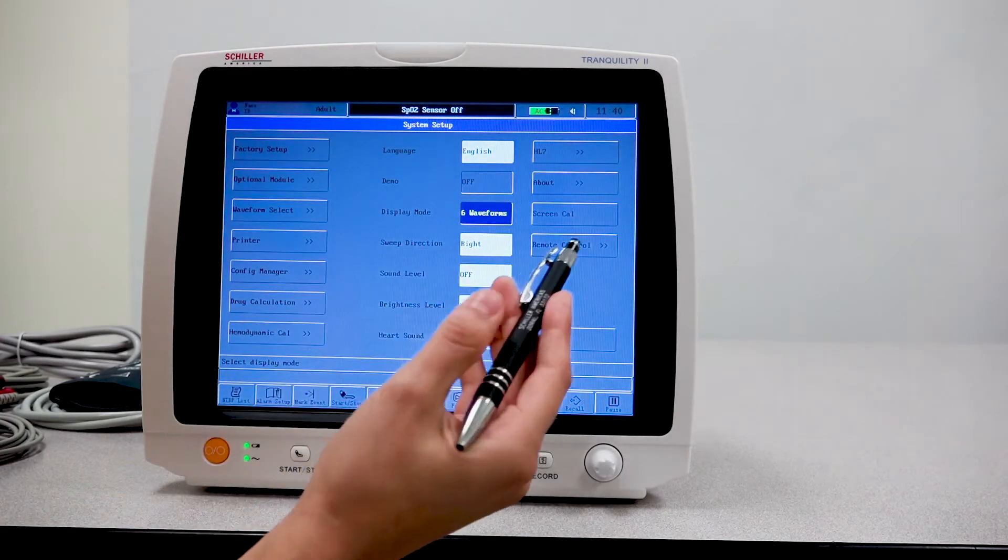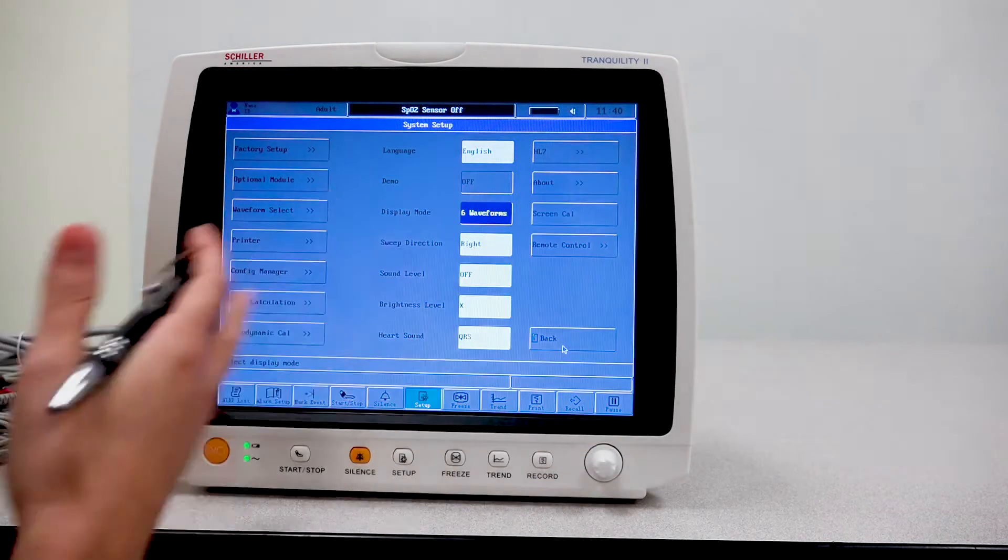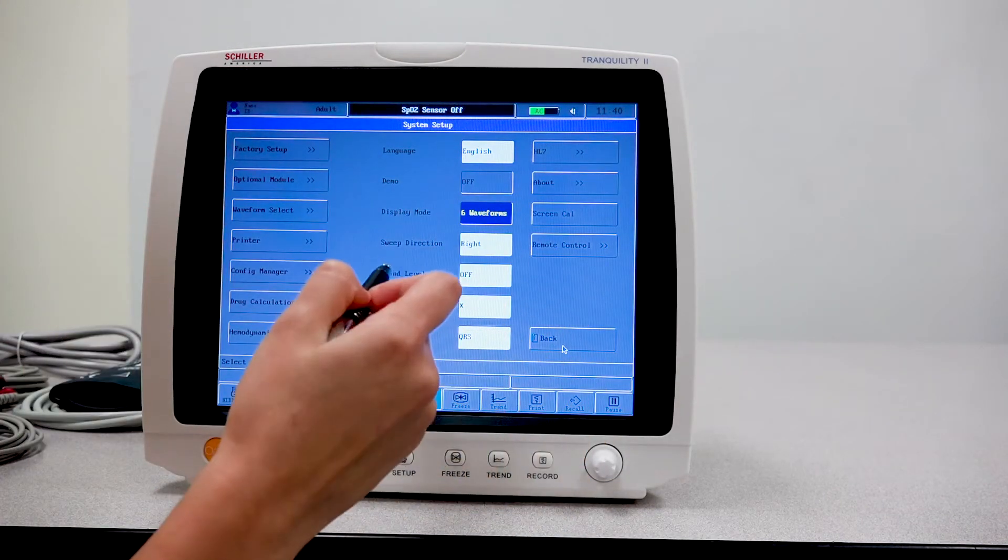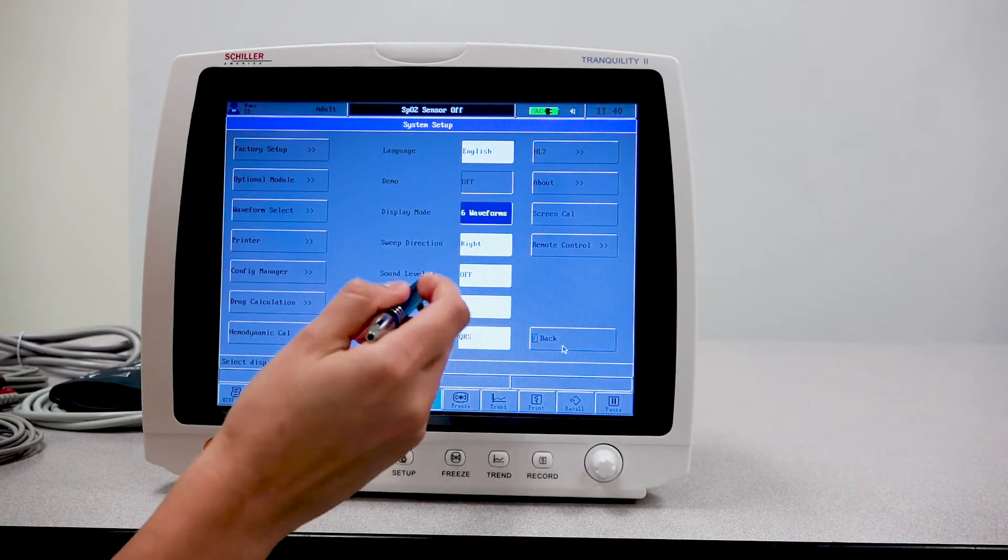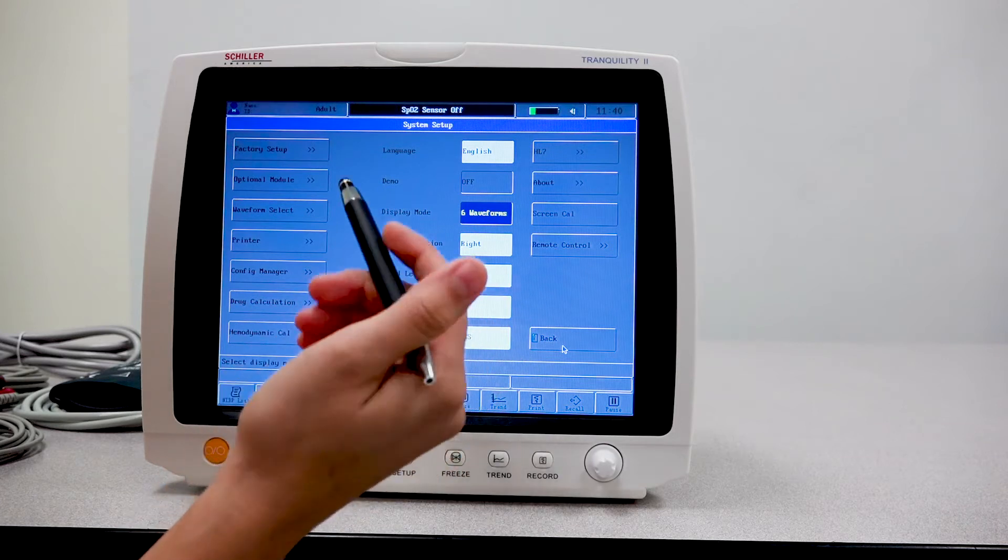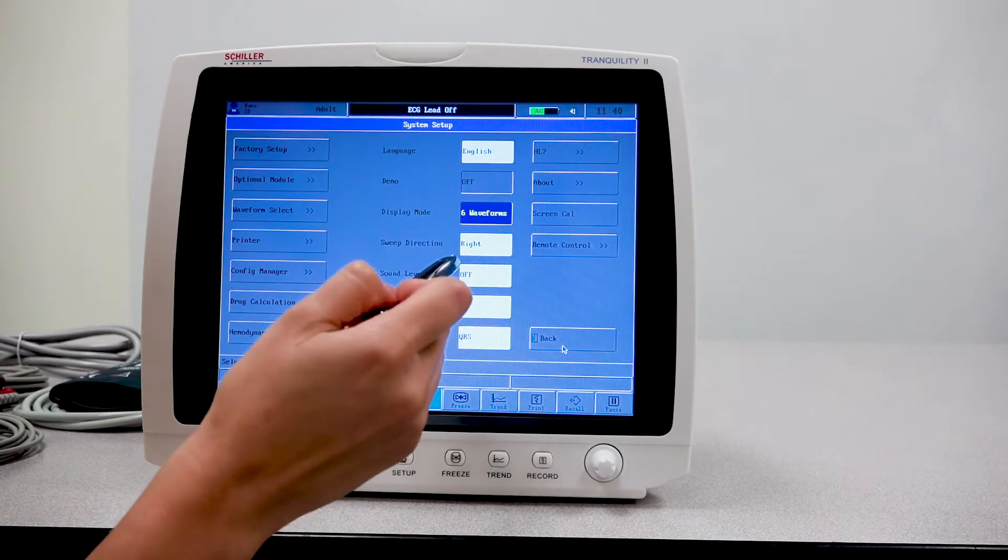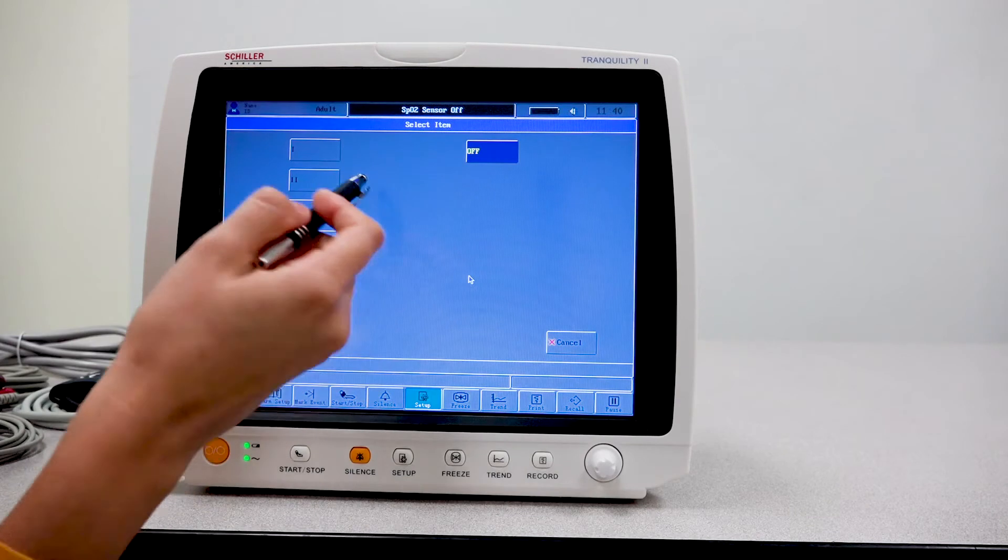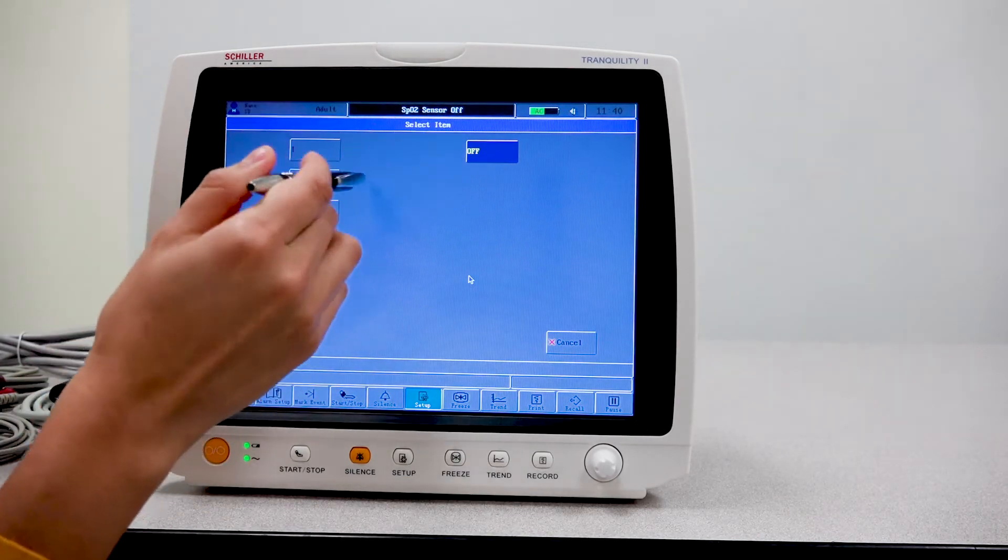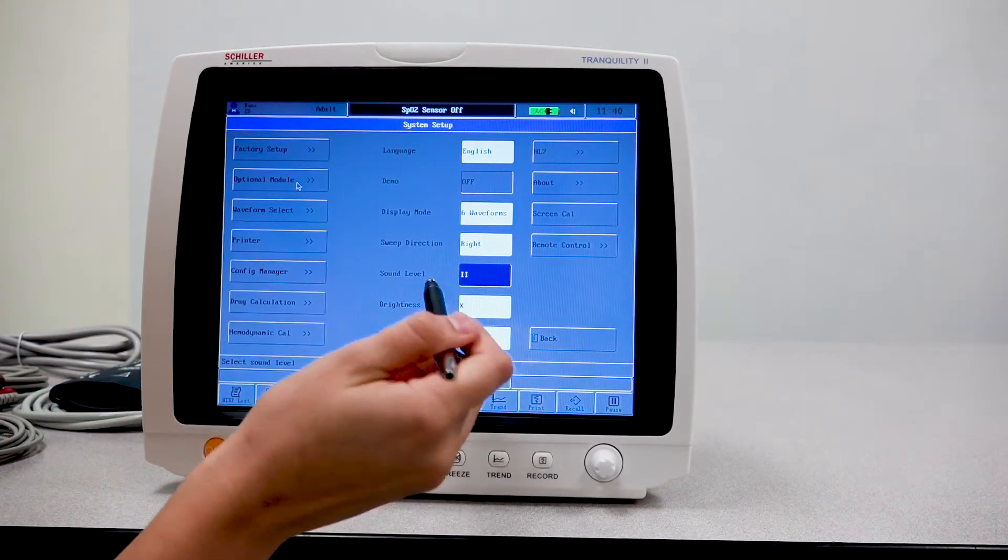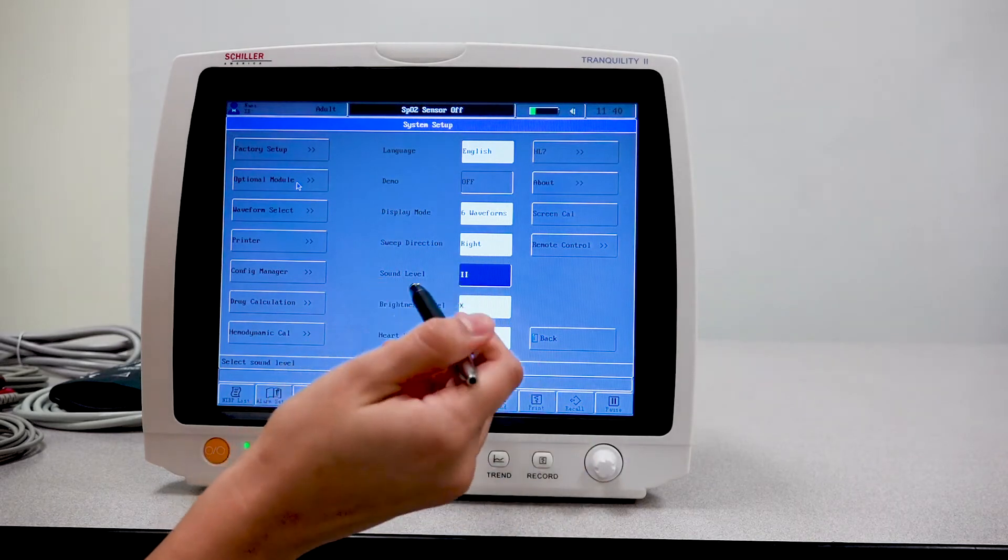You have your sweep direction and which way you want the waveforms to go, left or right. Your sound level, right now I have it off for the purpose of the video. But normally this will be on and you can select the levels of the sound.